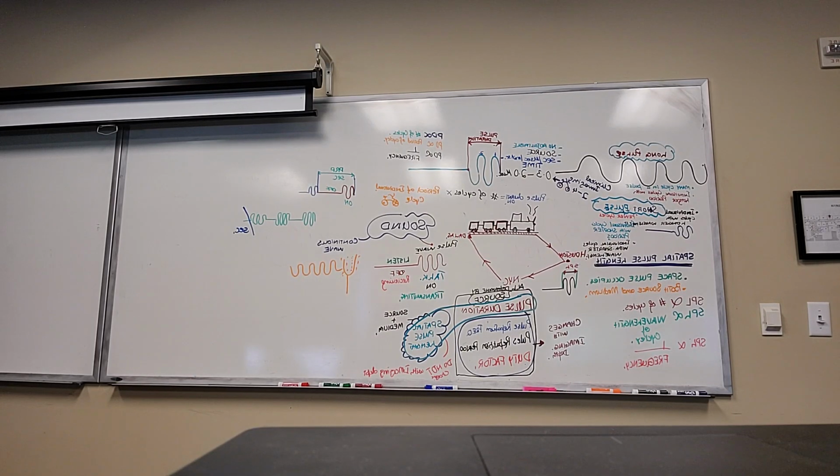What is the PRF determined by? Not imaging, it's determined by the source. But it's affected by the imaging, right? How does it get affected? When the depth of view increases, what happens? It's indirectly related. So when the depth increases, the PRF decreases.